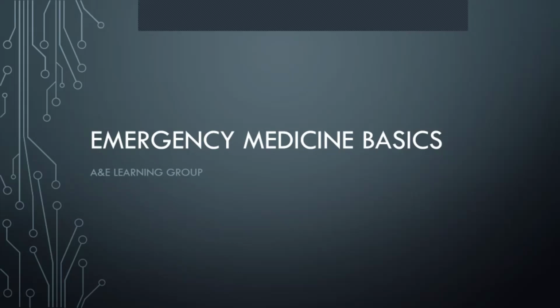You know, they gave us an extra X-ray that we can look at, and they put it up. And having overheard some conversations about the lateral X-ray, it's become quite obvious over the years that a lot of doctors are not really sure what the purpose of the lateral X-ray is. So that's what I'm going to try and go through today.